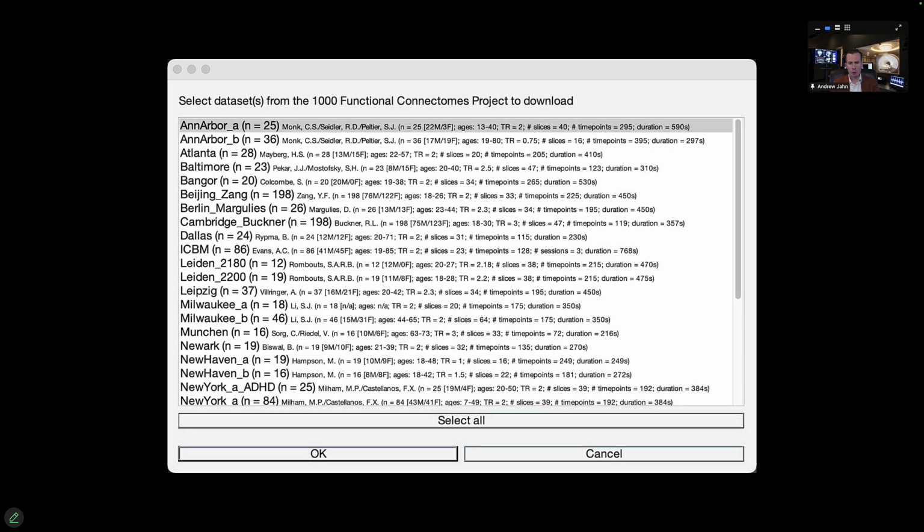So I'm going to give you a brief demonstration here on my own machine. So through the CONN Toolbox, you'll notice that you are now these days, as far as I think a year ago in their latest versions, you can directly access things from the 1000 Functional Connectomes project, one of those databases I mentioned earlier, and download everything and pre-process it in one go. So with minimal intervention, you can download any of these satellite sites and download the images and pre-process them.